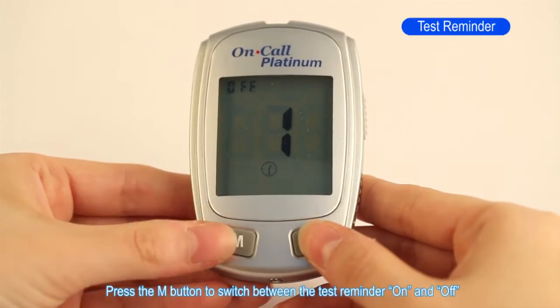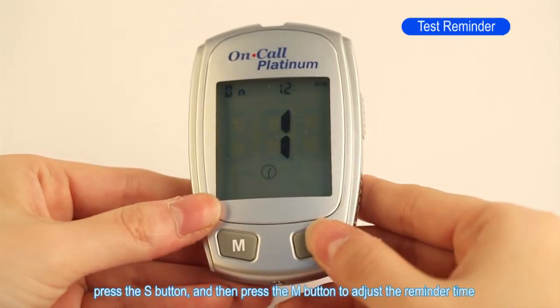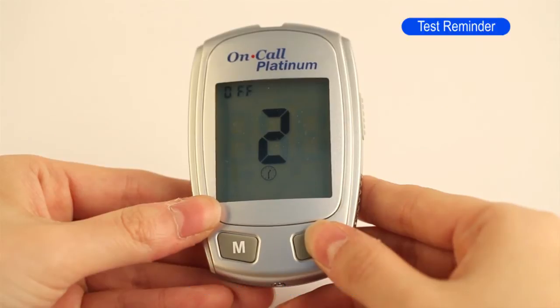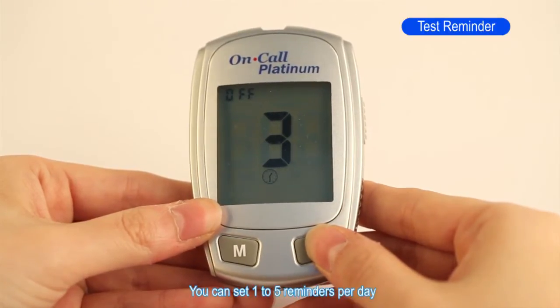Press the M button to switch between the test reminder on and off. Press the S button to confirm your selection. When the test reminder is on, press the S button and then press the M button to adjust the reminder time. Press the S button to save your choice. You can set one to five reminders per day.